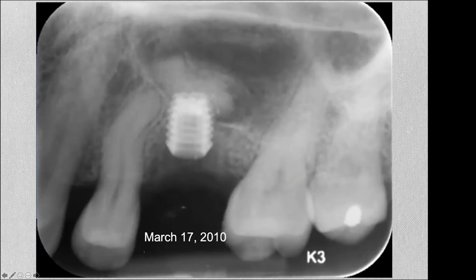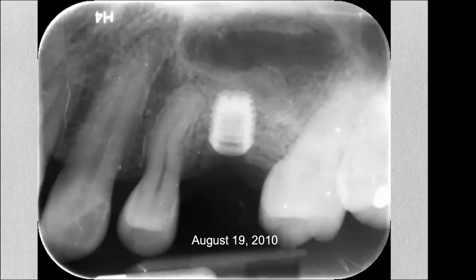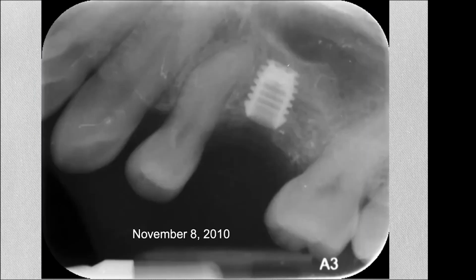However, if we look at, again, the space between the 2 contact points, and we draw a line straight down through the center of the implant, vertically through there, we get right in the middle or near the middle where we want it to be. Okay, this is 5 months later at uncovering. Notice how this settled. You can see how well this bone remodeled, integrated, and settled nicely. Just for one implant, it's totally worth it to do the internal lift using the ultra short implant.